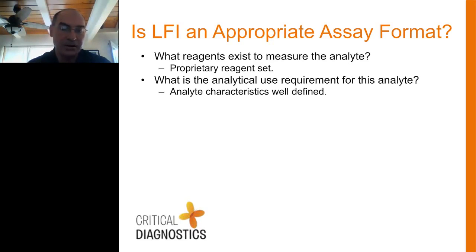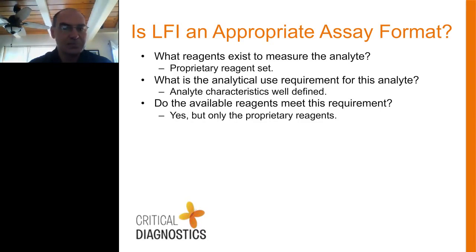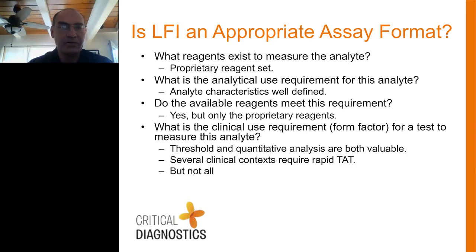So we started evaluating technology that we could have access to that wasn't encumbered by other intellectual property, and that's lateral flow. So we have the reagents to do that, so we answered that question. We know the analytical use requirements. So could we develop a test to do that? We said we already have the reagents to do it. We know the form factor, we know where it's going to be used, how it's going to be used, and then could we develop a business case to do that, which we did work on.